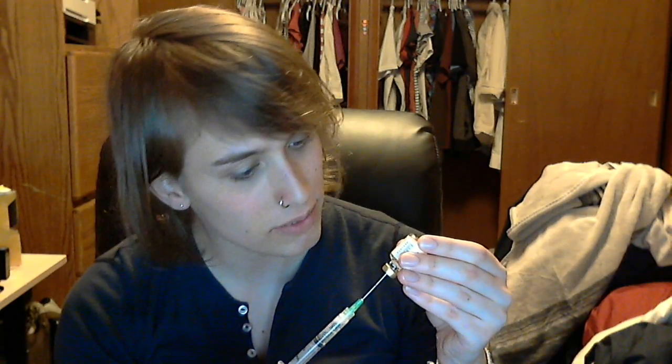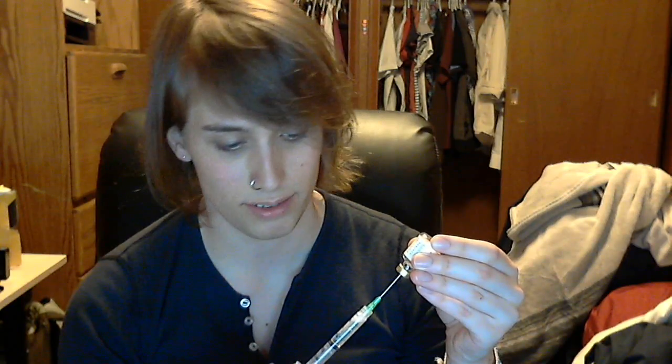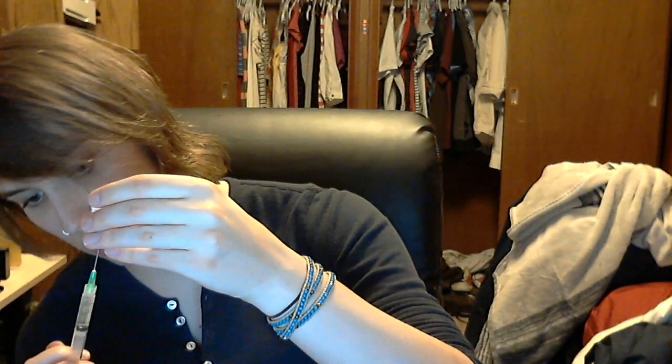How these things go. Oh my god, I got a shit ton of bubbles. I'm supposed to be showing you guys how to do this well. That's what I get for talking while I'm doing it. Yeah, so this part kind of takes the longest, unless you're really afraid about stabbing yourself, which I am, so I can't really make fun.